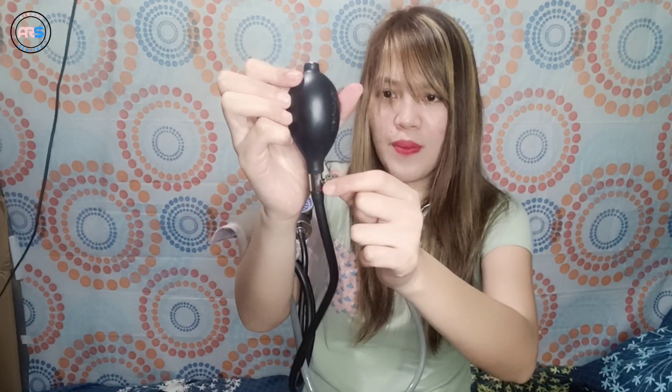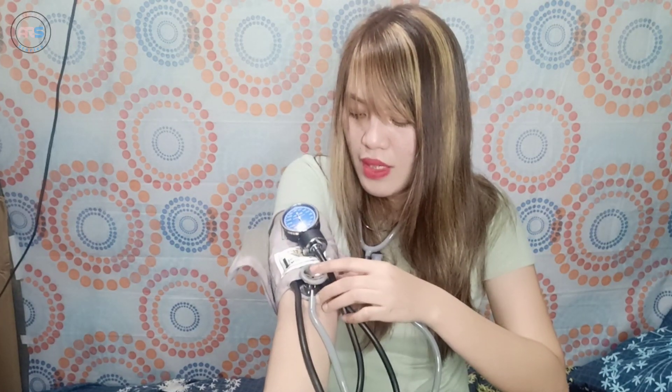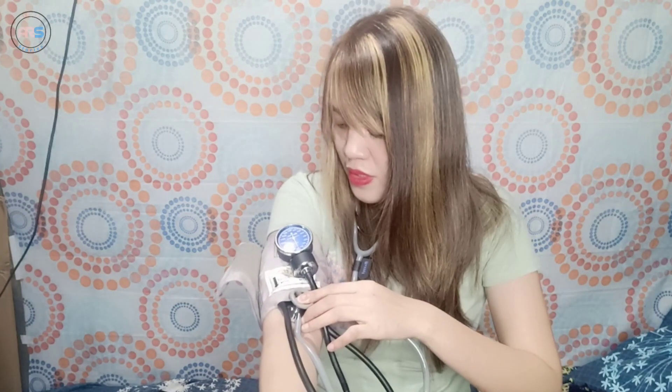So, ito — yung valve natin at saka yung air releasing valve. Kailangan nakalock po itong air releasing para ma-inflate po yung cuff. Okay? Open na yung bell-shaped diaphragm. Kailangan tatakpan ito para marinig natin yung pulse sa brachial part natin. Let's go! Patungha ko yung manometer.